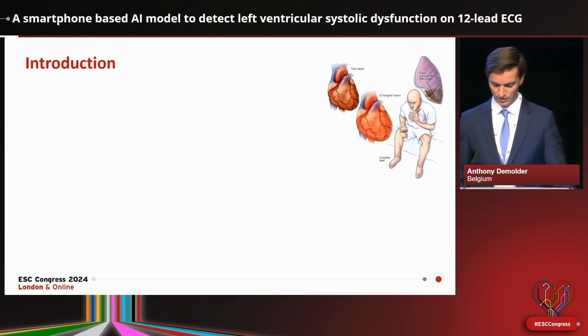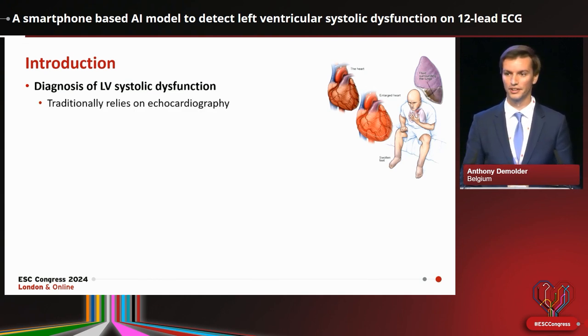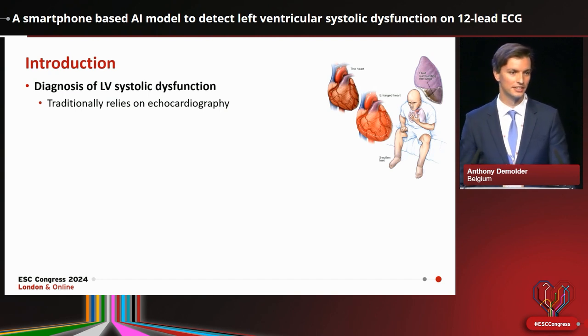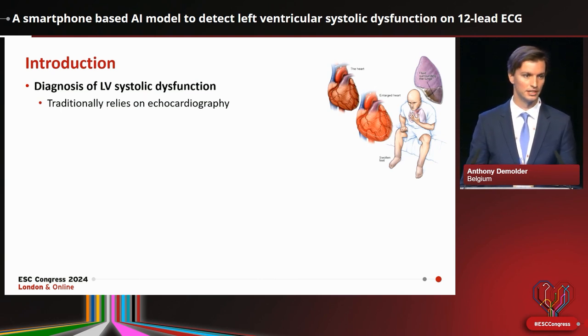So we all know that the diagnosis of LV systolic dysfunction is definitely a hot topic in our field. Unfortunately, this diagnosis traditionally relies on echocardiography. And we know echocardiography is an imaging modality that is resource intensive. It's not readily available everywhere. And we also know that it is expert dependent. So we need experienced sonographers to perform echocardiography.